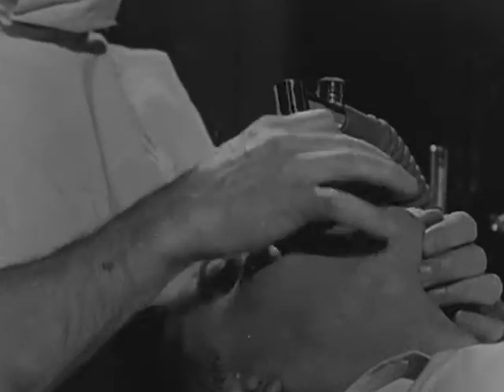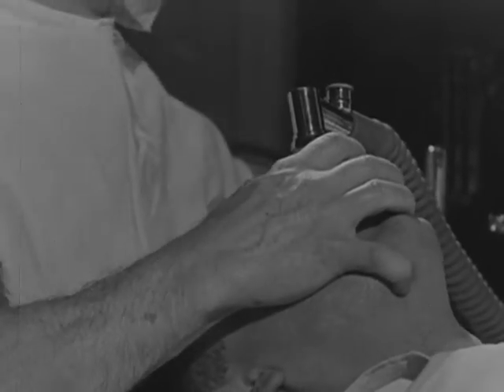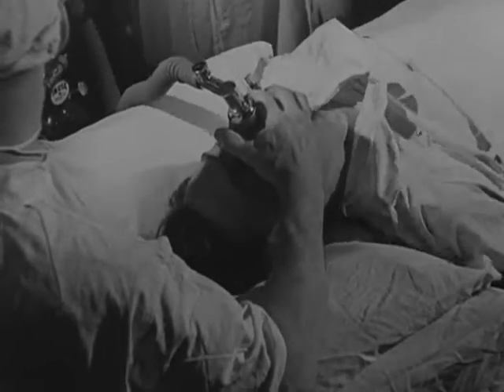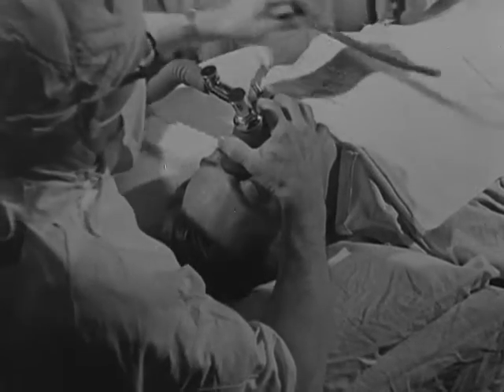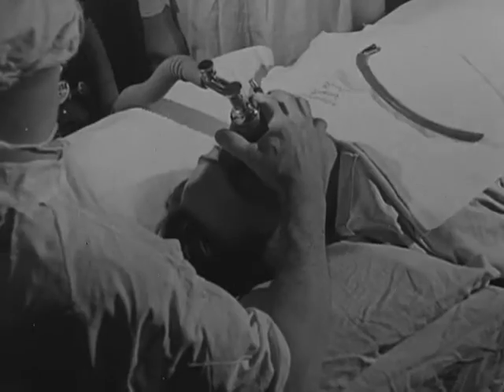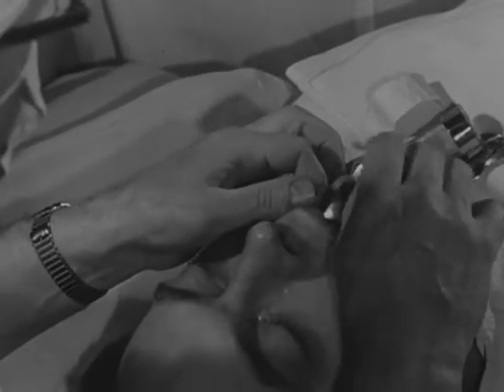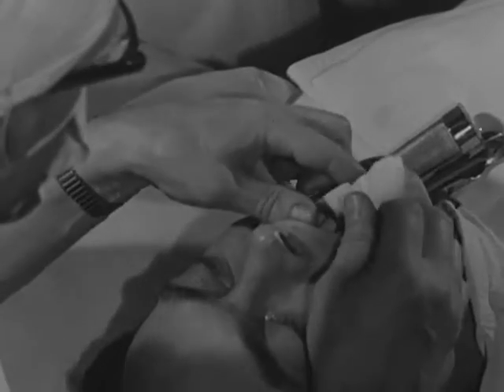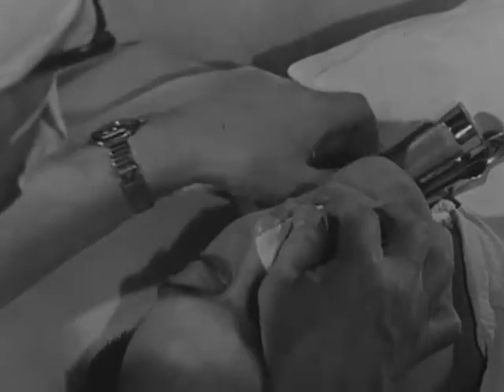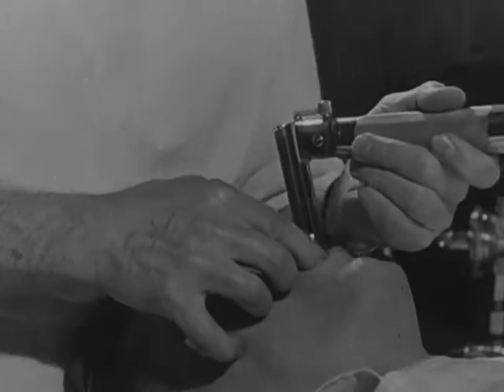First, anesthesia is induced to a depth sufficient to relax the mandible. For the beginner, it is a good idea to deepen the anesthesia even further and so make sure that the patient will still be deep enough during the passing of the tube. Remove the airway and place the folded piece of adhesive plaster over the edges of the upper teeth to prevent them from being damaged by the laryngoscope. The lips and teeth are separated with the fingers and the laryngoscope is passed between them along the dorsum of the tongue.